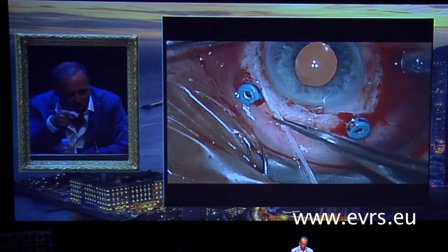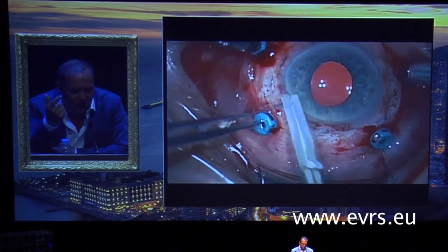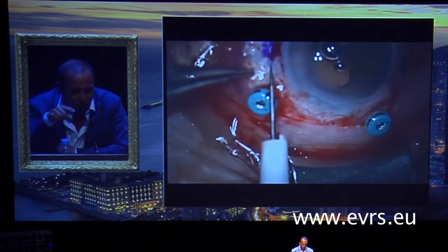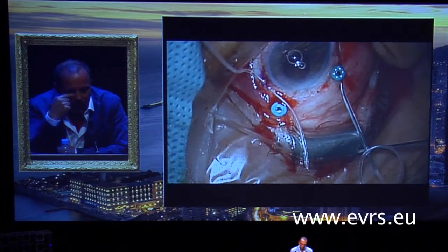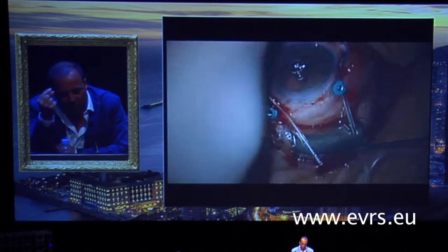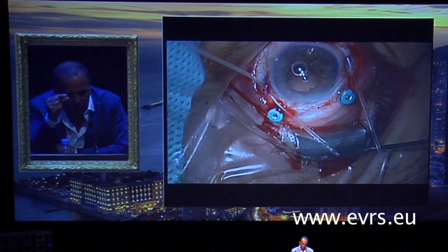I use this cannula to fix it, but it's very difficult. So the idea is to create two intrascleral tunnels. I use this tube that is used for the lacrimal canal, and I create the way of the haptics with the tube.